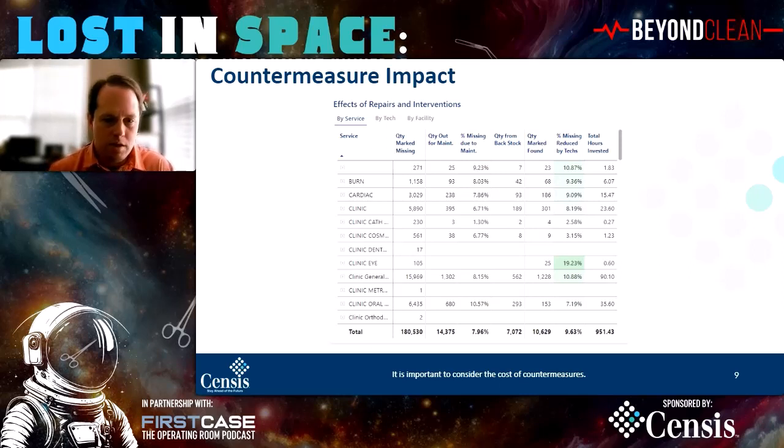If that technician gets credit for going and finding that instrument amongst other trays, or going and pulling it from backstock or the pegboard or wherever they can get another number 3 knife handle, then they're incentivized to complete that tray 100%. And it's much more likely that that tray is going to be completed. It's much more likely that they're going to find that instrument if it got mixed up with another tray, and end up not going into a drawer and costing the facility money.